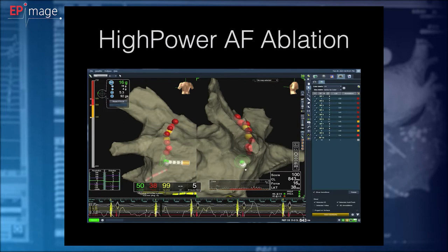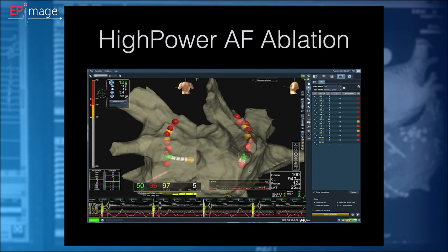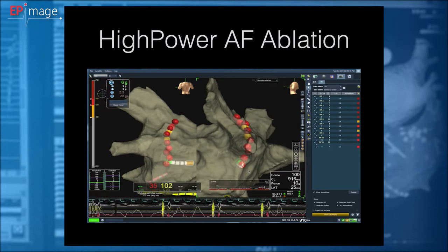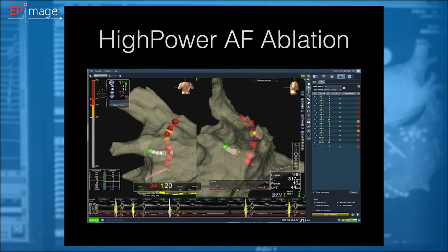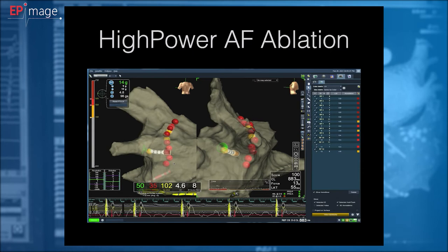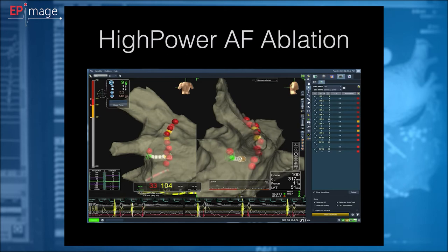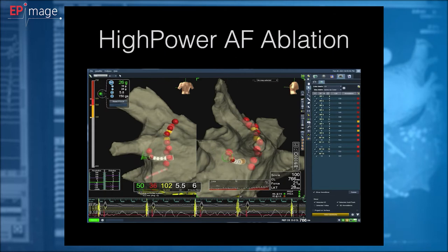Our patients during ablation are sedated, but they are still alert. So we have full contact with them, and what I've noticed when I start to jump on posterior wall, apart from using high power, which is in fact less painful for a patient, is that the applications are even more acceptable by patient, and we have fewer applications which were stopped by the patient feeling pain. So that's the reason I'm jumping on posterior wall.